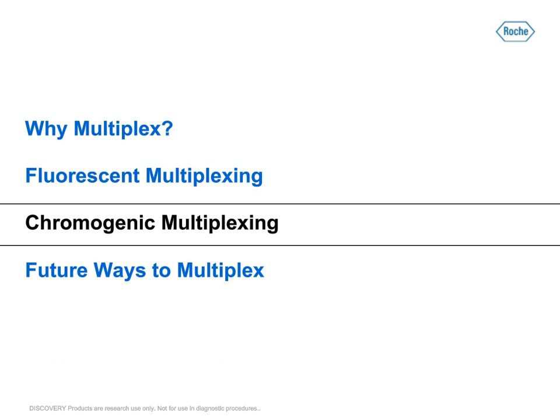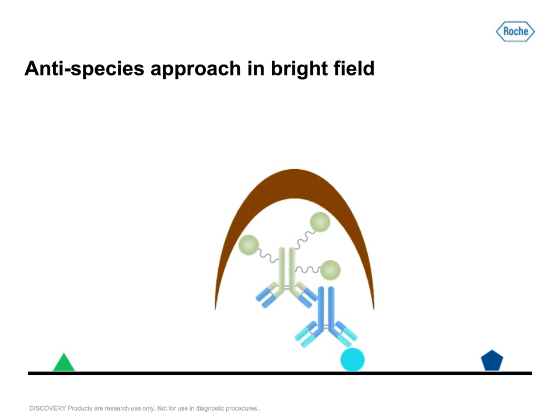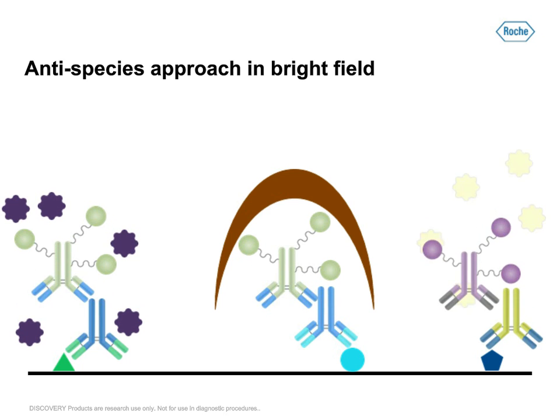All right, so chromogenic multiplexing. When using brightfield, you can take pretty much the same approach that we discussed in fluorescence. So if you have your primary and then your secondary enzyme conjugate, you can use DAB and utilize the umbrella effect that it has. And then when you come in with your second antibody of interest that you're trying to interrogate, and then turn over whatever chromogenic substrate you want, and then your third, and then that can turn over, in this example, a yellow chromogen.